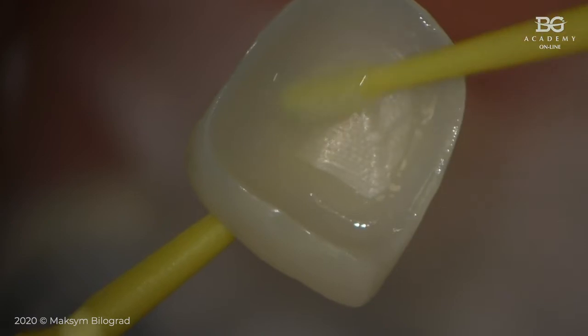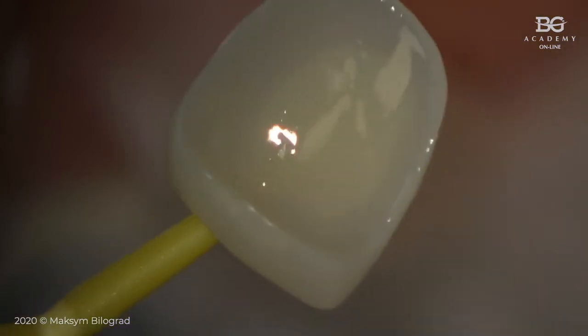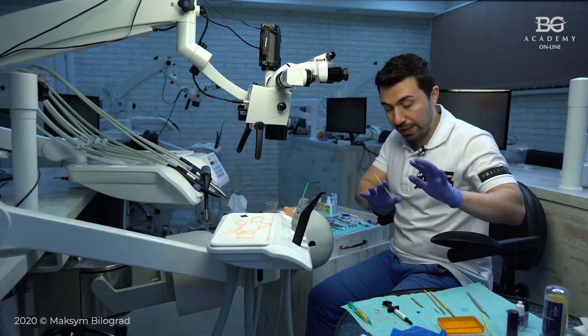Okay, one really thin layer. Done. That's it. Okay, and then you can put your veneer anywhere you want. You can put it on your table or anywhere you want.